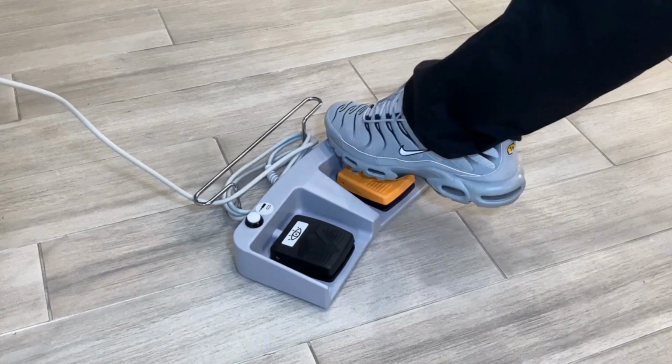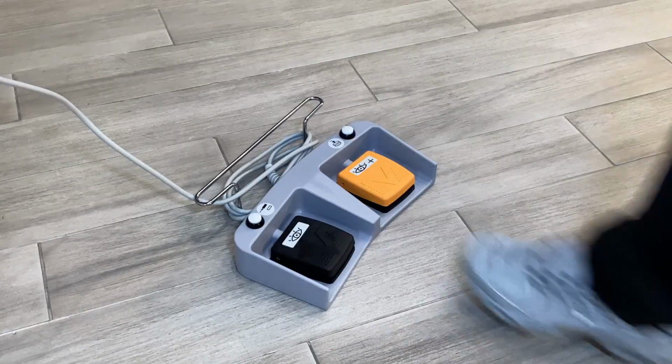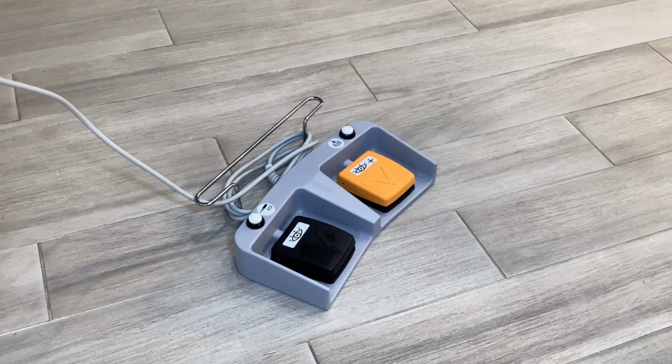Press the Save button to save the image on the left area of the monitor and Cine. A short step on the Save button will save the image. A long step on the Save button will save the Cine run, known as Cine Save or Fluorostore.